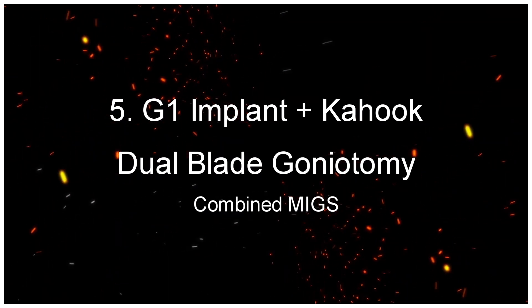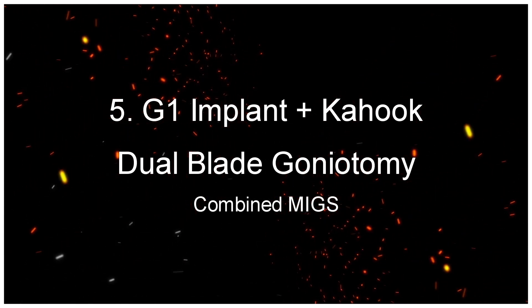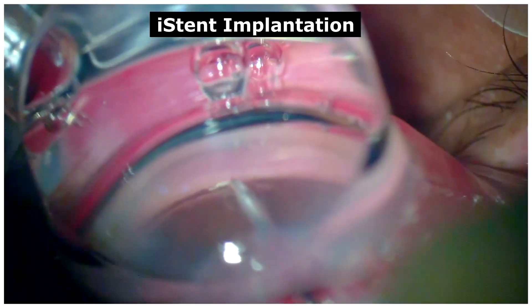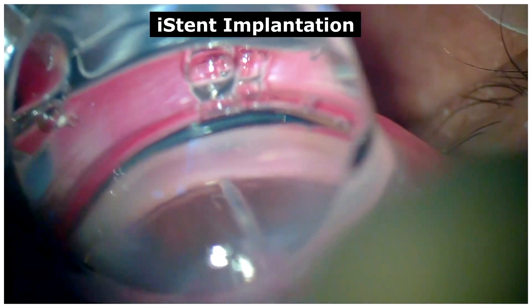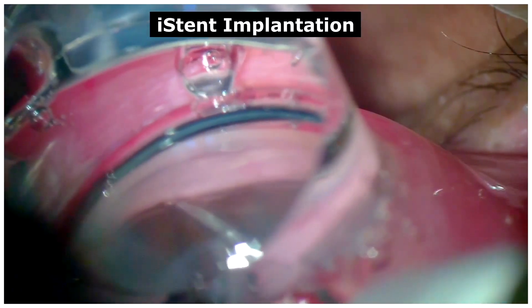G1 implant plus Kahook Dual Blade goniotomy, the combined MIGS. Here we have a case of a G1 iStent implantation which was successfully implanted into the trabecular meshwork.